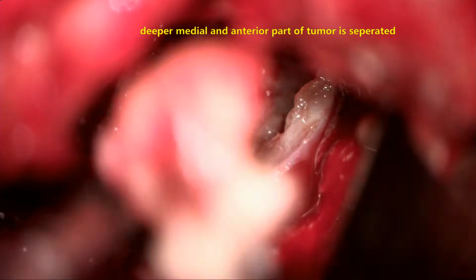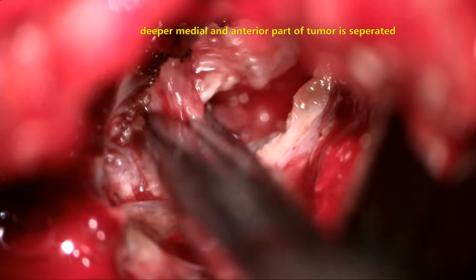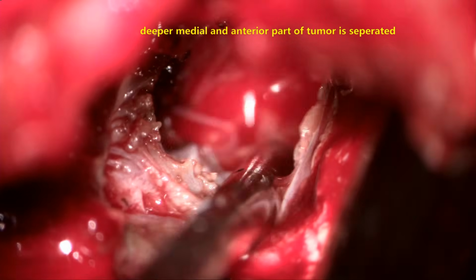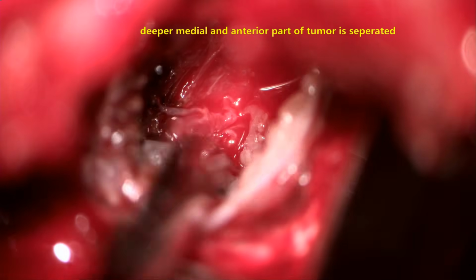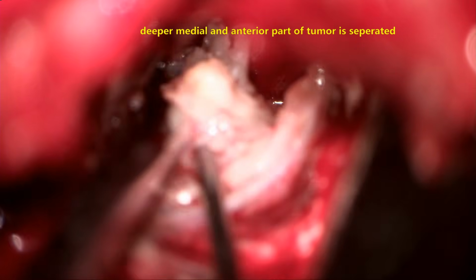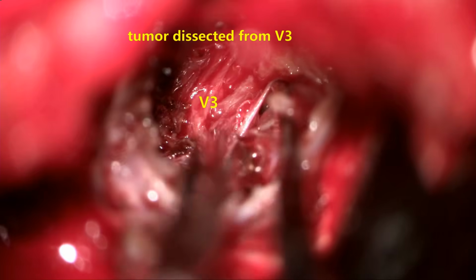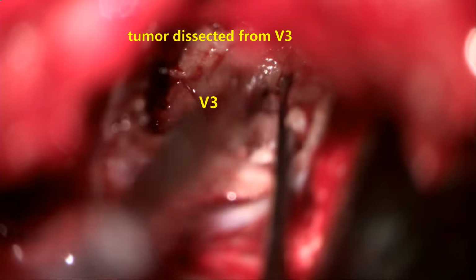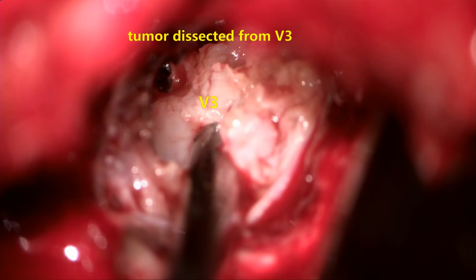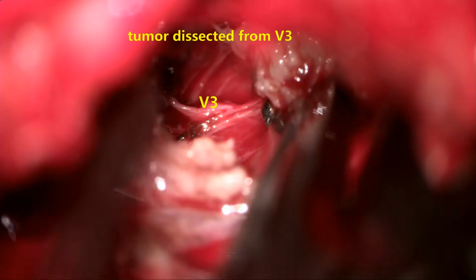Now we are going deeper and deeper, and the anterior and lower part, the inferior part, is being dissected and removed. During this procedure, one needs to be very gentle and careful because at this juncture you will get the internal carotid artery coursing below the temporal base in the petrous part and going medially to enter the posterior and lateral wall of the cavernous sinus. That fact needs to be kept in mind.